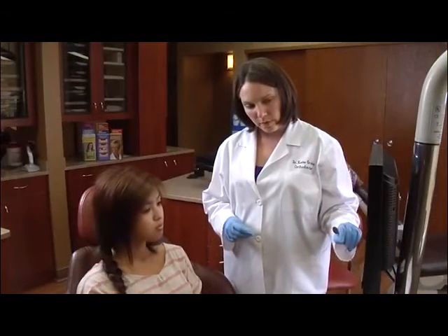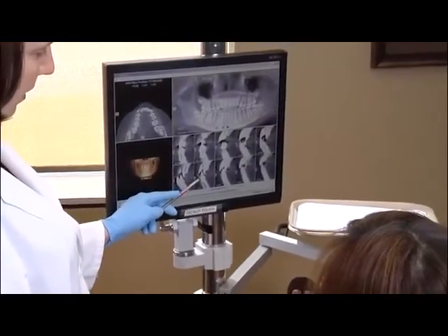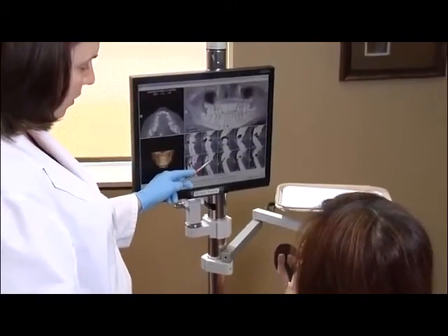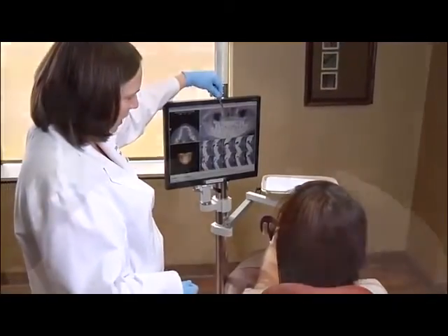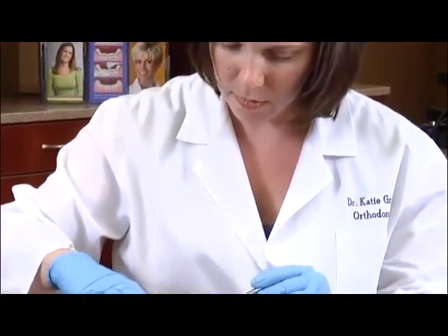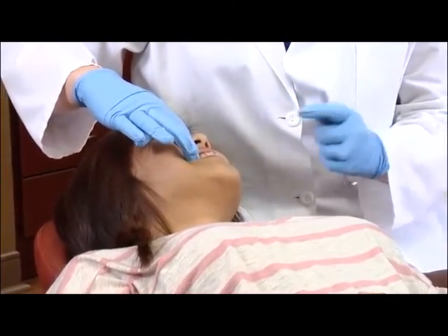Finally, TADs may be used as part of an orthodontic treatment program, which will prevent more costly and intrusive dental work. The patient may return for orthodontic brace activations and use of the TAD almost immediately. Some patients have their TAD in for only a portion of their treatment, with as little as 6 months, while for others, they have them in for the duration of their orthodontic care.